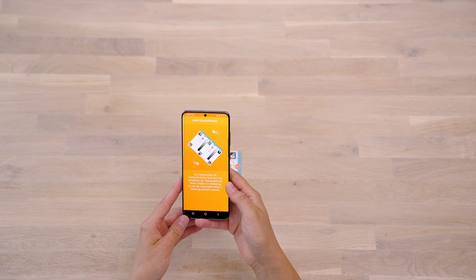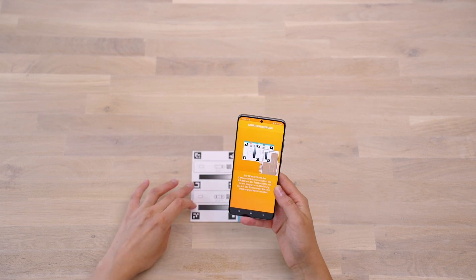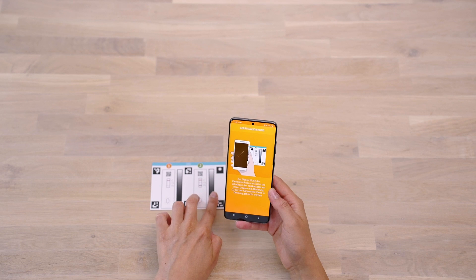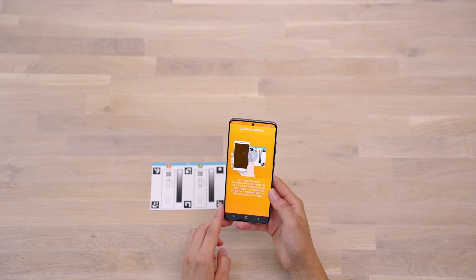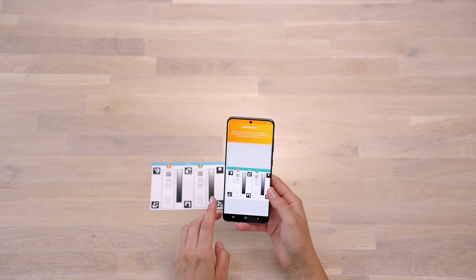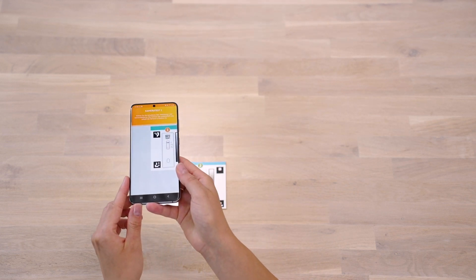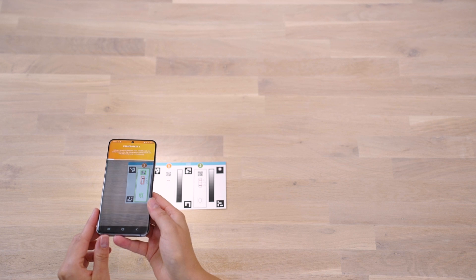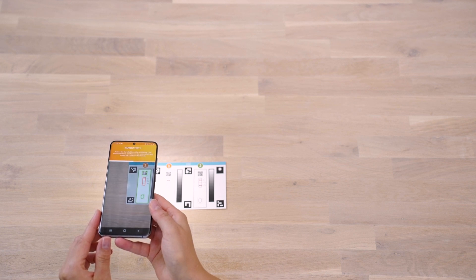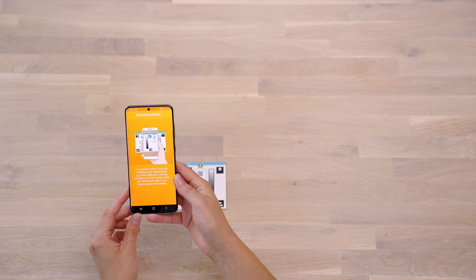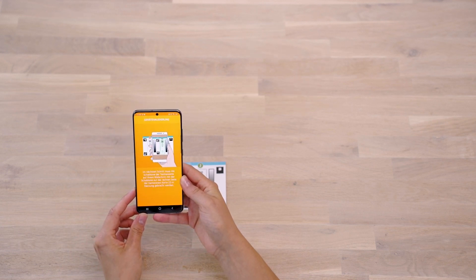If your smartphone model has already been released, you will be taken directly to the camera test. Place the camera test card with the blue bar facing to the top. Scan figure 1 and hold the smartphone still until the progress bar has run to the end and you have received a success message. Repeat this step with image 2.